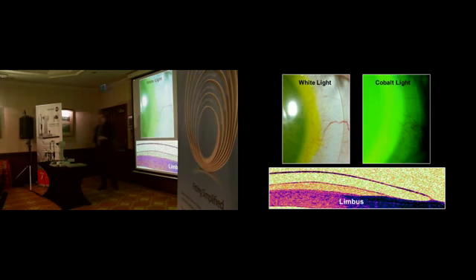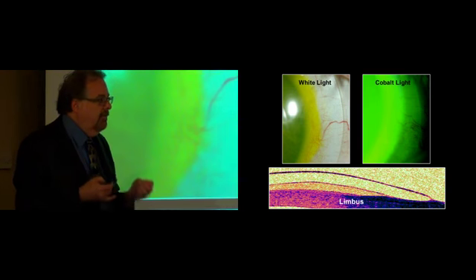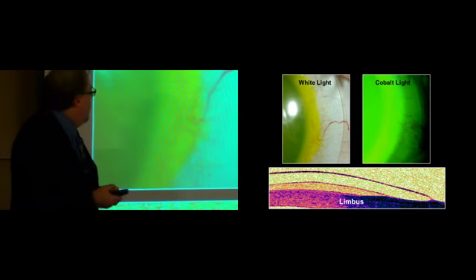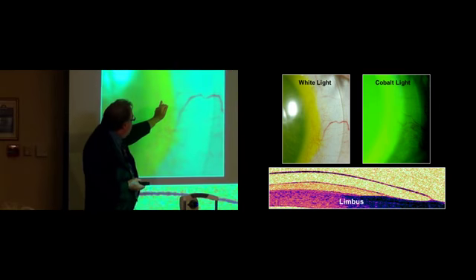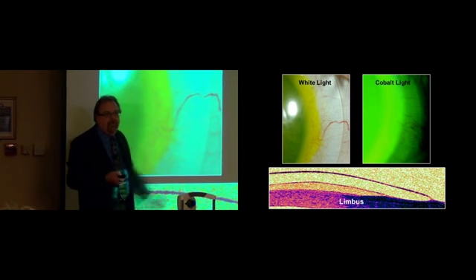Now, that means that when we're visualizing a scleral lens, there is a very important area for us to look at, and that is the area beyond the corneal boundaries. What we want to see here is fluorescein bleeding over beyond the limbus onto the sclera.